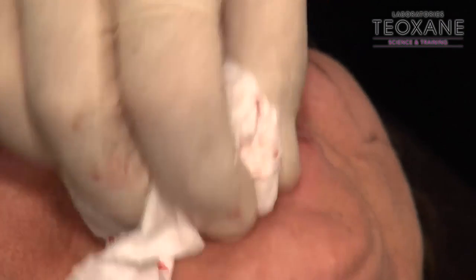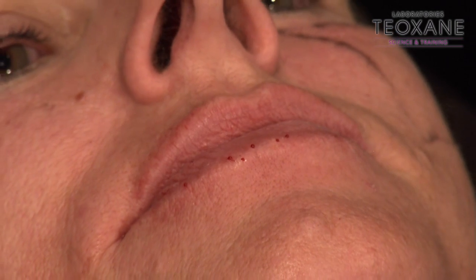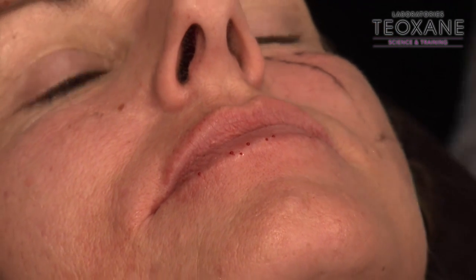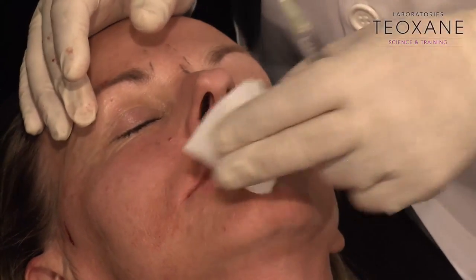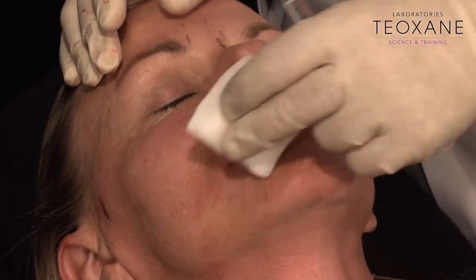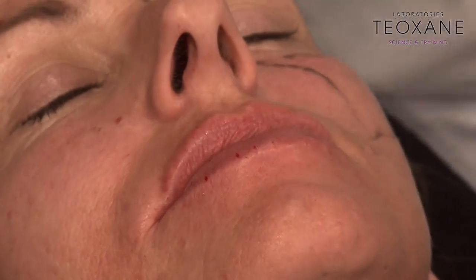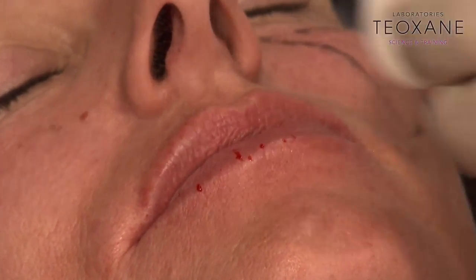Great. So I reshaped her lips. I didn't add volume, I just re-outlined the lips. Now I'm going to show you something I haven't done for a long time. Take me back 30 years, when we used to do blanching with collagen Zyderm in the 80s. That's what we could do for the fine lines above the lips. It was difficult to do recently with Teoxane Global or maybe some Redensity. I don't know, I never tried it for this sort of thing.